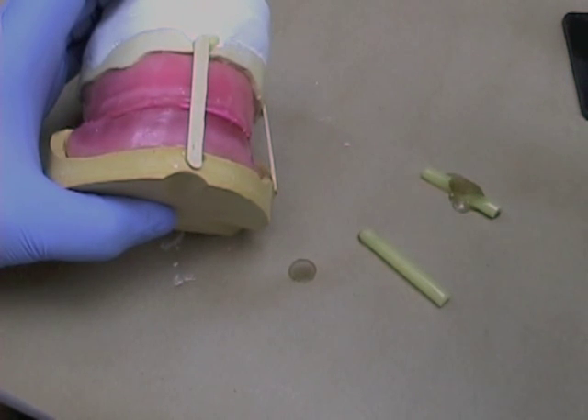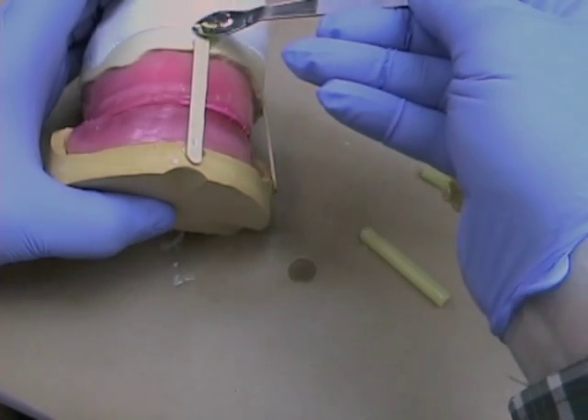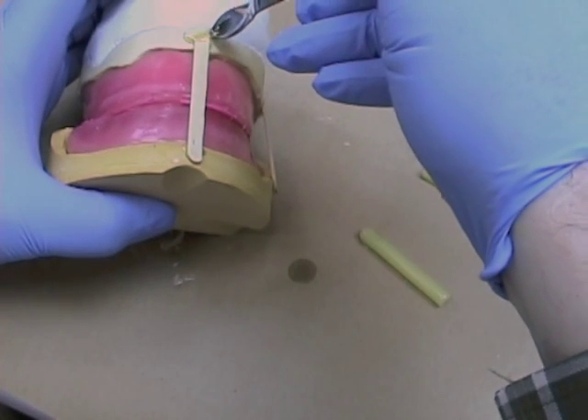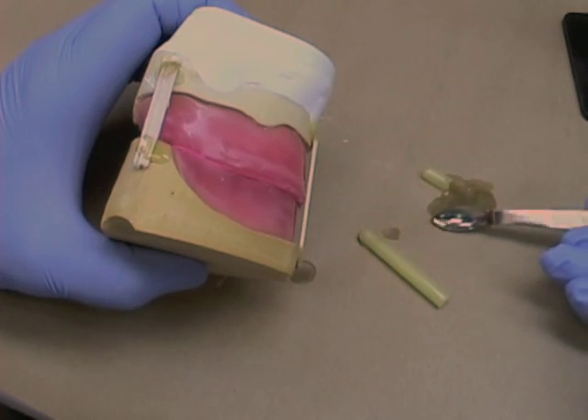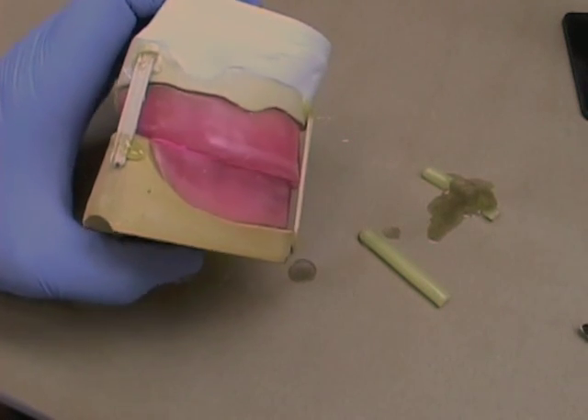Do the same in the anterior region. You may need to use a slightly larger stick in this area, and again make sure it's sealed well to the cast. Lastly, add a third stick at the back, and again make sure it's well sealed to the cast so it can't move.